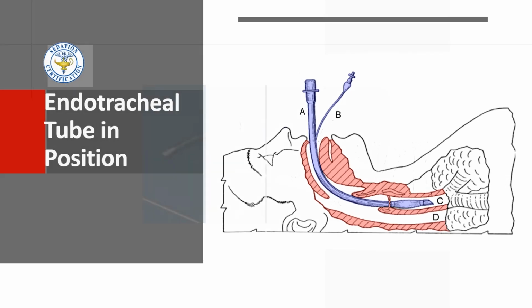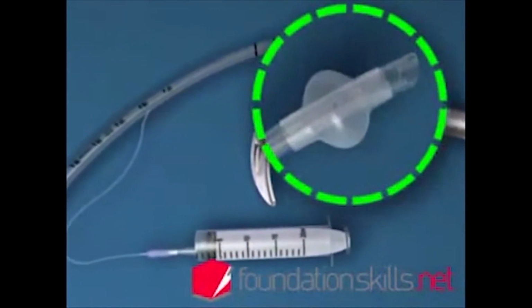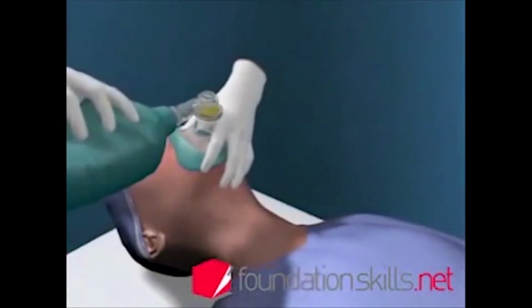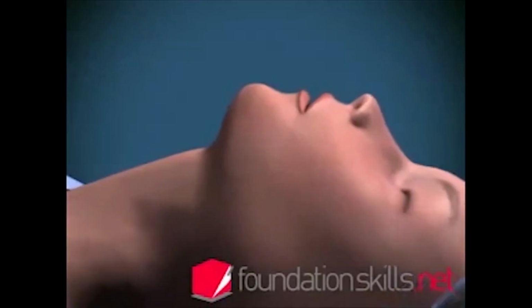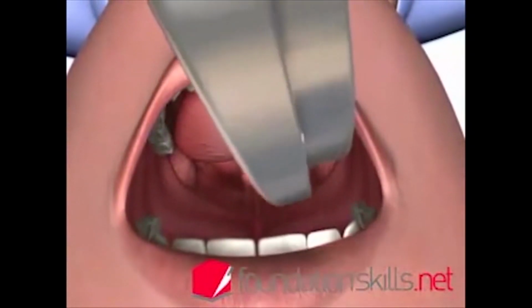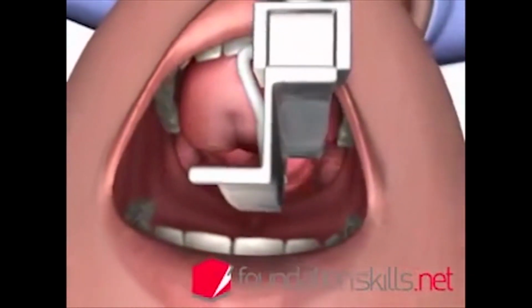Ensure that the equipment is prepared and check that the laryngoscope is working and the cuff on the tube inflates and deflates properly. Pre-oxygenate the patient with bag and mask ventilation for up to 1 minute before attempting to intubate. Standing behind the patient with the head in the sniffing the morning air position, with the left hand, insert the curved blade of the laryngoscope into the mouth over the right side of the tongue, displacing it to the left and upwards.